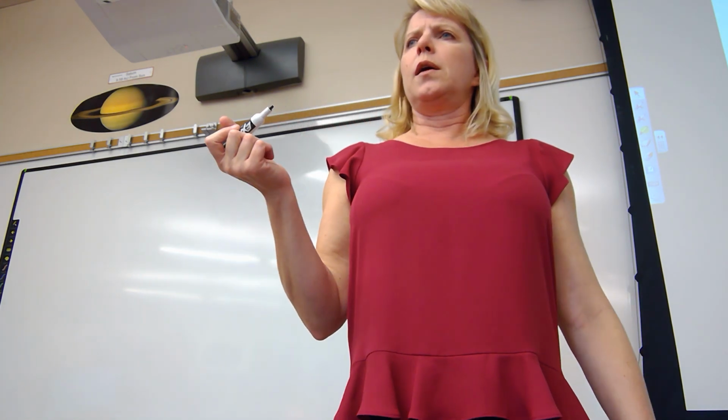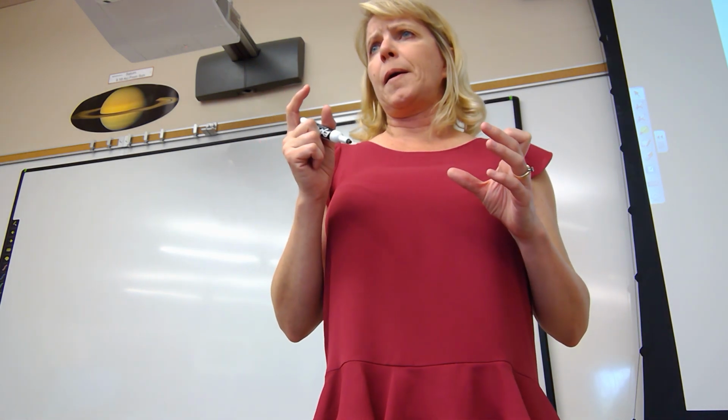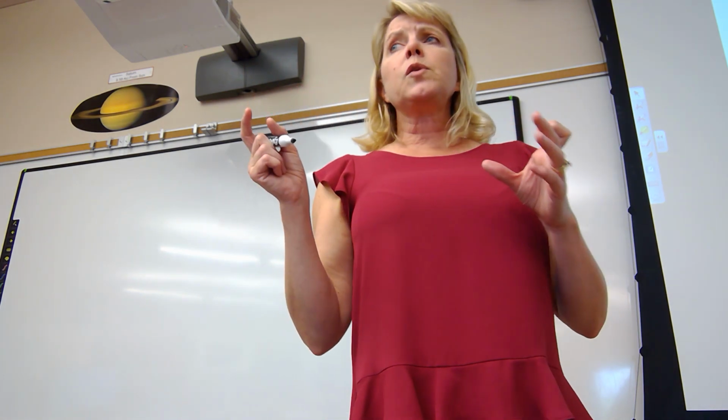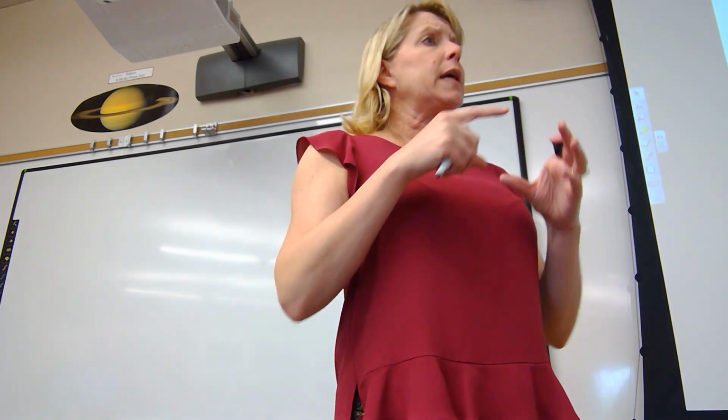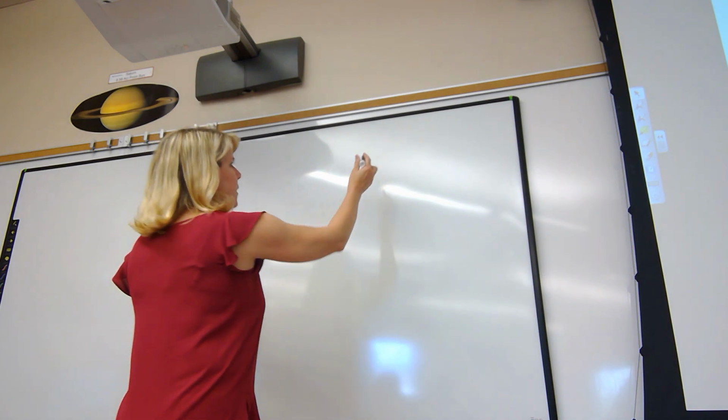And I said on Tuesday, you should be able to draw all of those 6 leads in a hexaxial diagram. And you should also be able to draw them individually in a circle. Do you remember? So a hexaxial diagram.